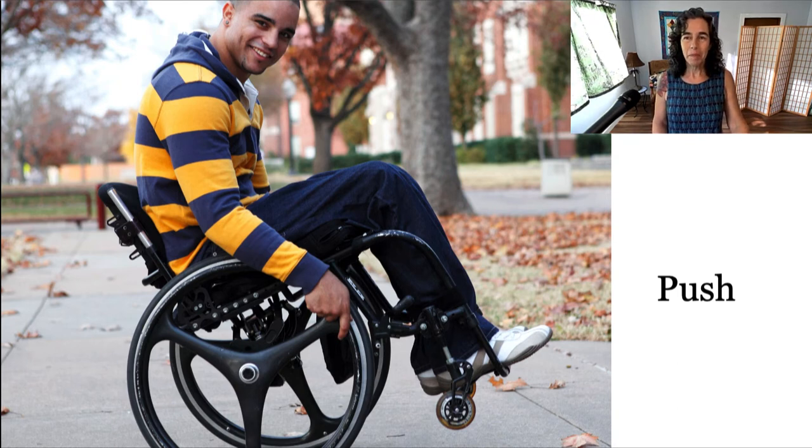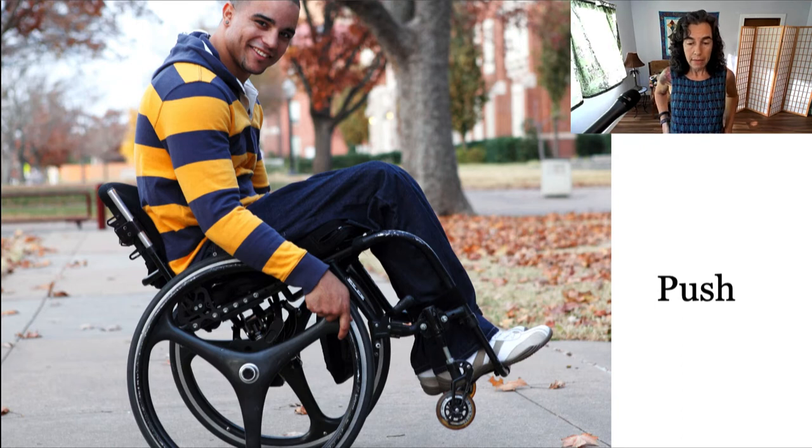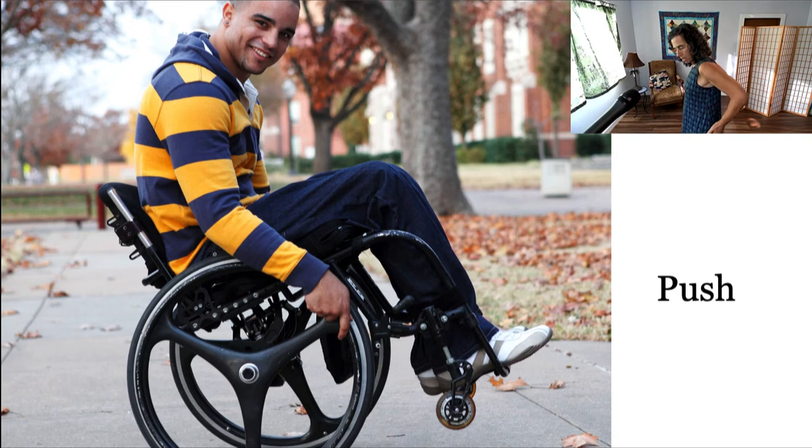The next thing I want to talk about is something called push. And push is how much power you get when you put your hands on the rims and propel yourself forward. The most ergonomic placement of rear wheels for push is in line with the hips, with the individual in the chair, and then you push starting from slightly behind your hips and moving forward. We'll look at a video of push to see what is the most powerful and also ergonomic and safe way to push. And it appears to be that there's an oval that's right around here. And so you push down and then you bring your hands back up.